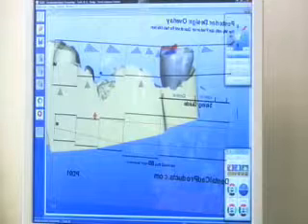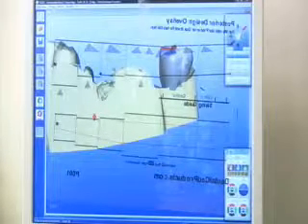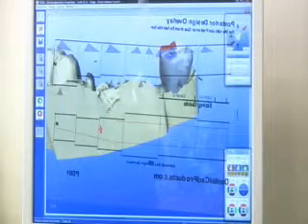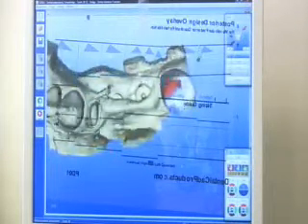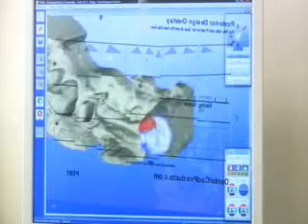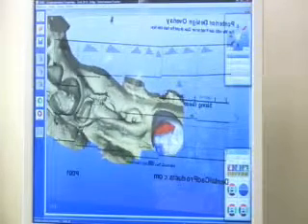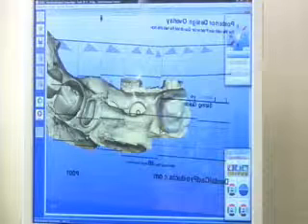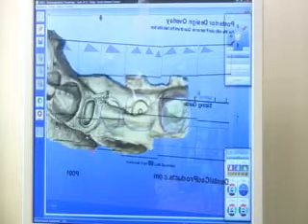If, in this case, the second molar drifted forward, what I want to do is have the premolars more of the same proportion as the cuspid because they'll be more noticeable, and cut down on the mesiodistal width of the first molar. But this case works out pretty good. The proportions carry through well.